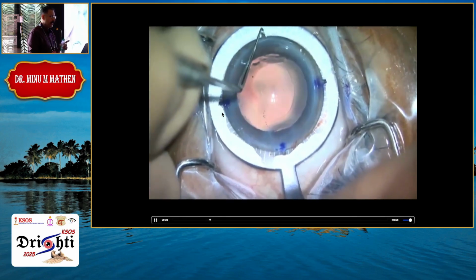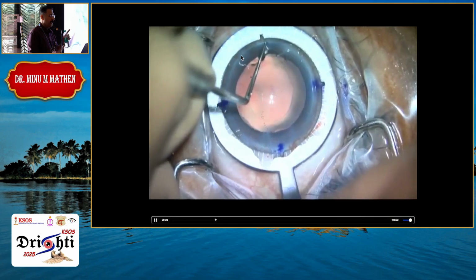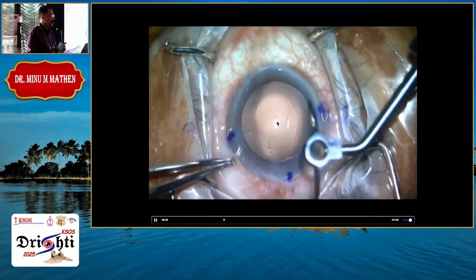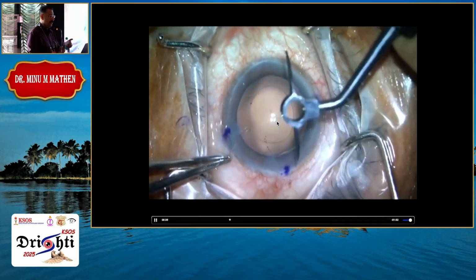The fluid will collect here. So that is what happens if you don't dry, and your mark also will get smudged. Use a very thin one and then mark. And also if you are blocked, make sure that your central point is also marked, and this mark goes through the Purkinje image, and then use this.